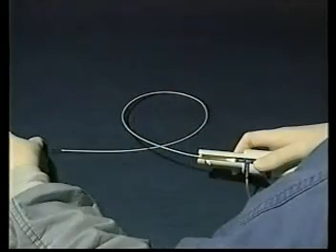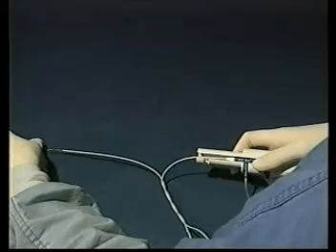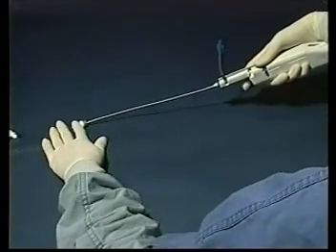Keeping the catheter as straight as possible helps avoid the wrapping up that can occur when the catheter is in a loop when the device is activated. This wrapping up of the cable does not occur unless the basket is unable to spin freely.